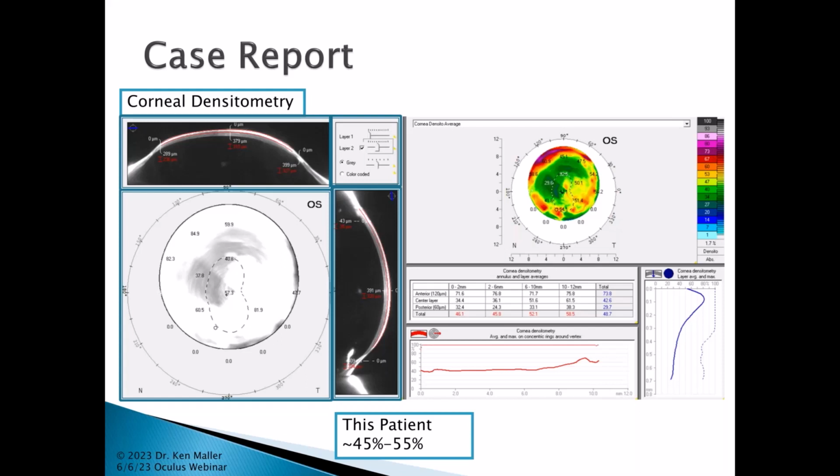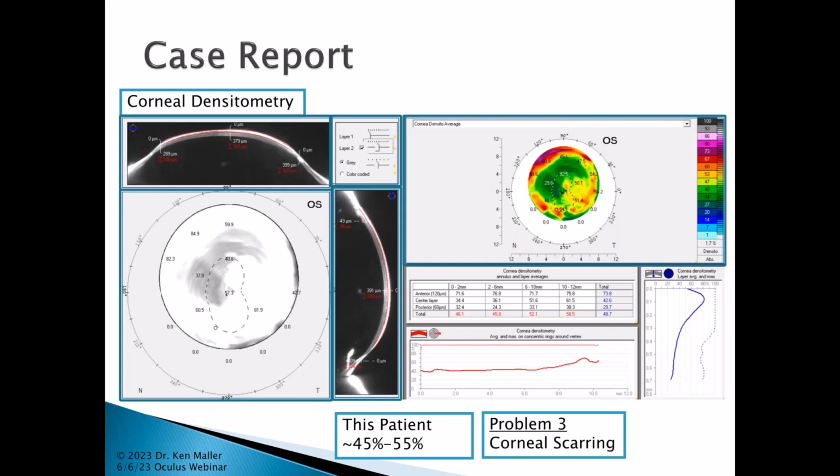And now you can see on the major picture there that we've had all of that reflectivity really confined to that anterior surface. This is the average of the scarring, or how much light is coming through that entire cornea. And again, this is just another prominent finding we're going to have for this particular patient's left eye as far as pulling any vision through, because we're having trouble getting light through this particular cornea.